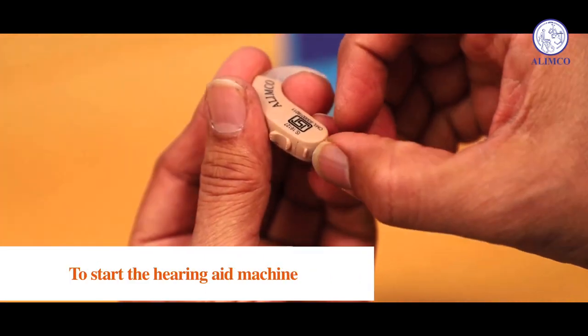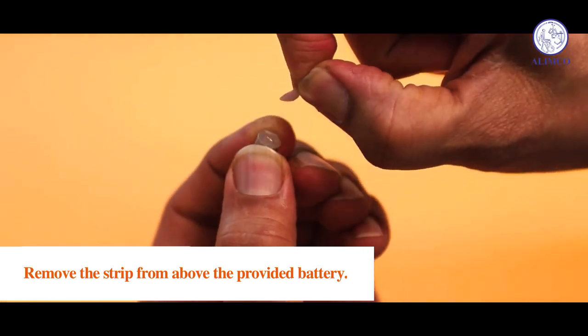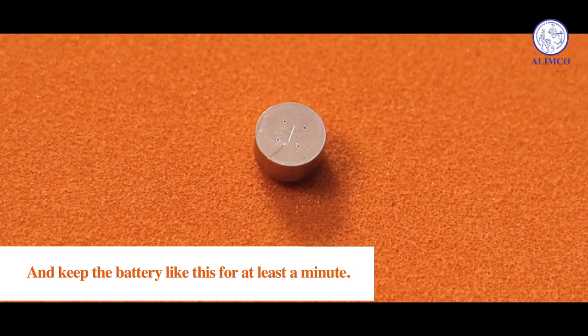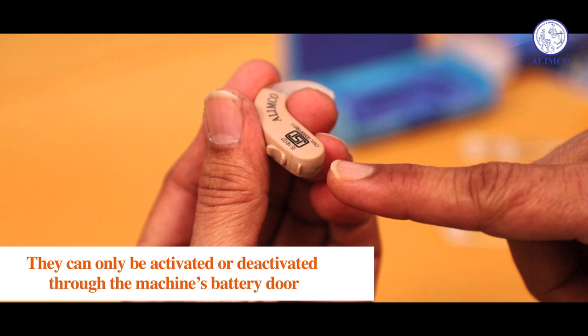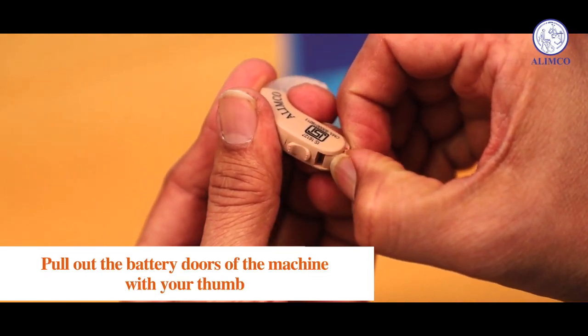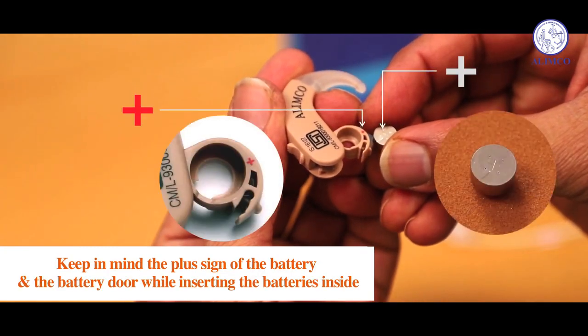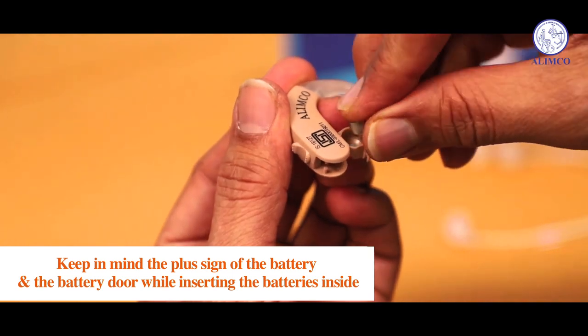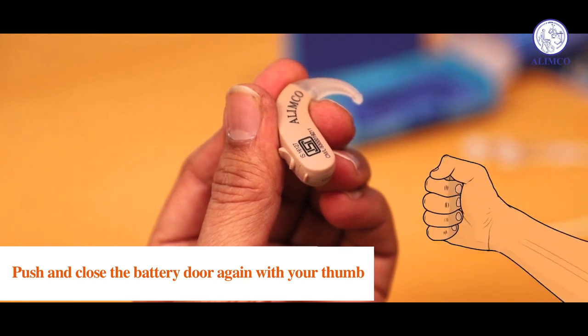To start the hearing aid machine, remove the strip from above the provided battery and keep the battery for at least a minute so that the battery becomes fully active. They can only be activated or deactivated through the machine's battery door. Pull out the battery door of the machine with your thumb. Keep in mind the plus sign of the battery and the battery door while inserting the battery inside.